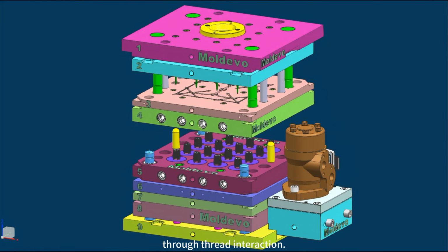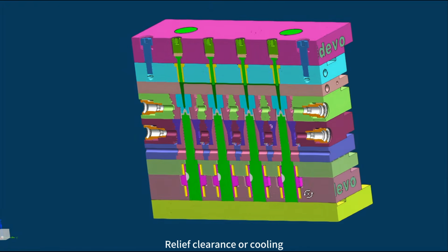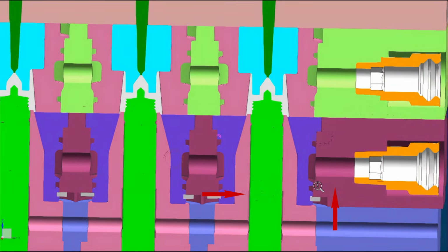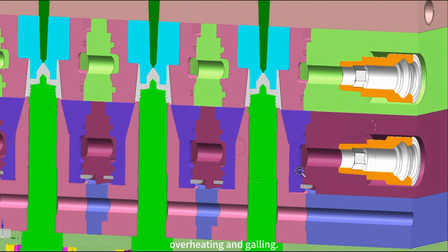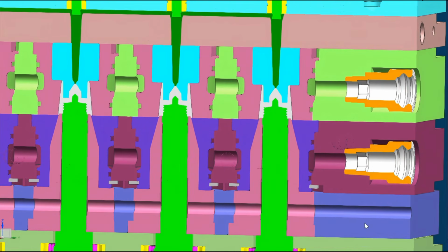Through thread interaction, plate 5 then ejects the parts. Relief clearance or cooling at the threaded insert head is recommended to prevent overheating and galling. Production stability is engineered.